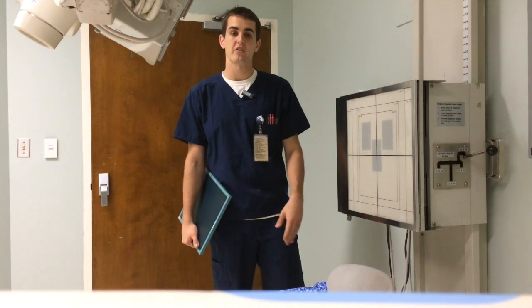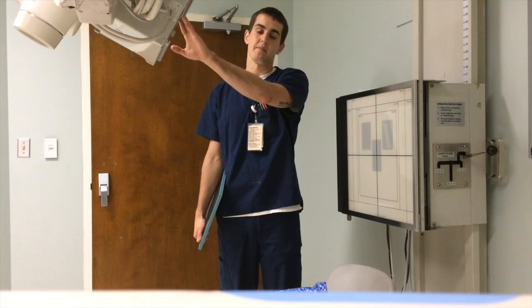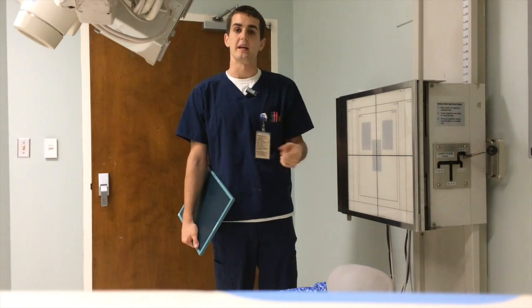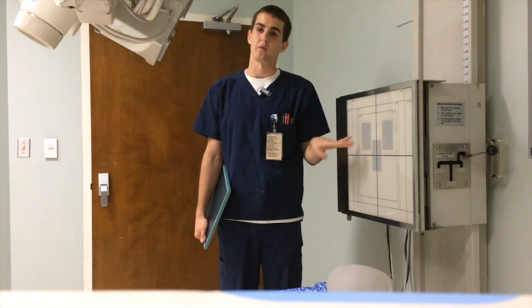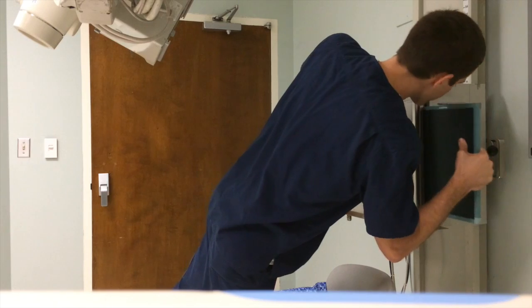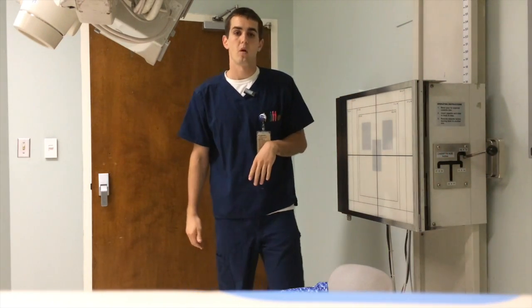We have shielding for our patient. We have a chair for them to sit down in. Like I mentioned, the AP axial Towne is going to be a caudal angle of 30 degrees. The tangential and the SMV will be a horizontal beam. So we'll put this in now. And we'll go get our patient.